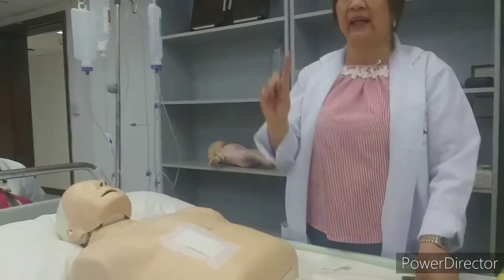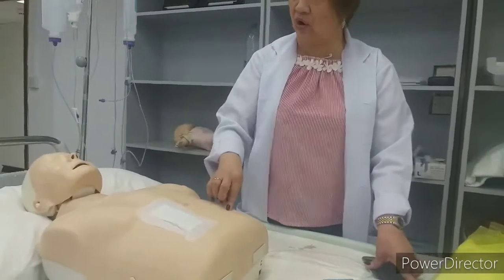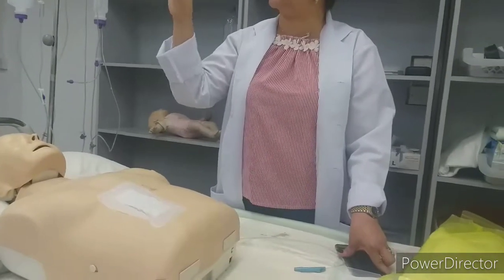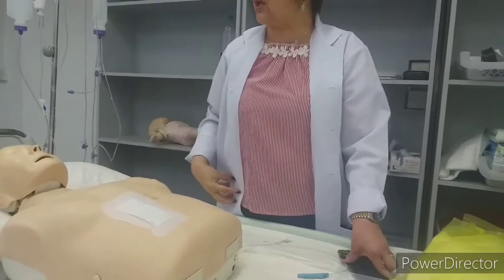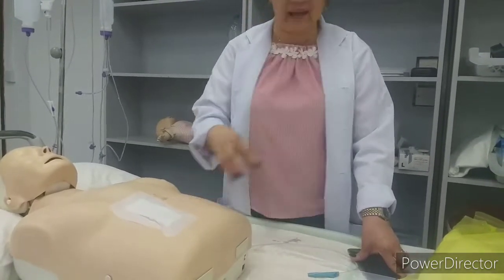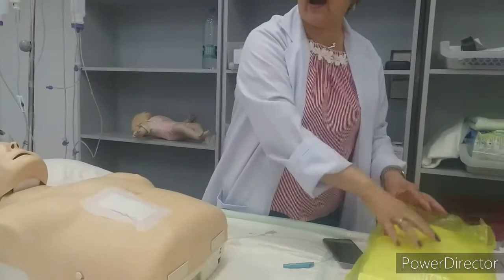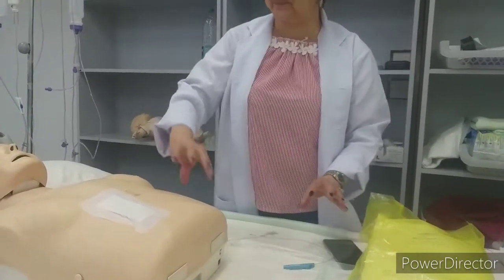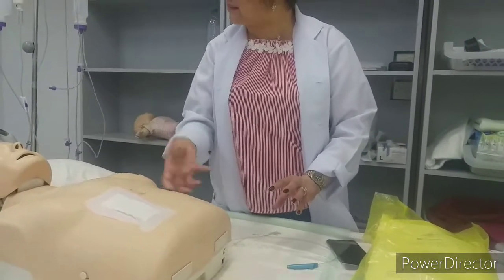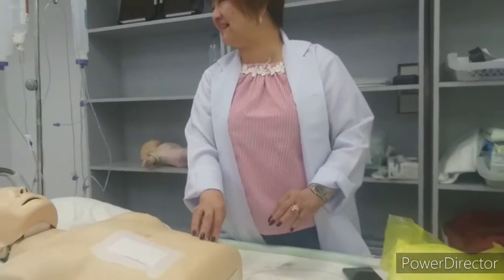Okay? So what we need to do, same. Get your betadine. There is like this wound, it depends on how big that colon is out. So first, if there is poo-poo here, get a gauze, even if it is moist or a dry gauze, and clean. You know how to clean, right? Clean it.